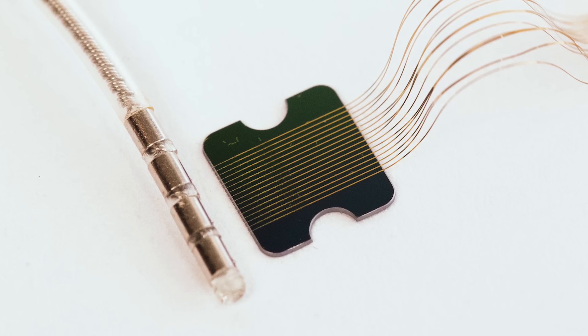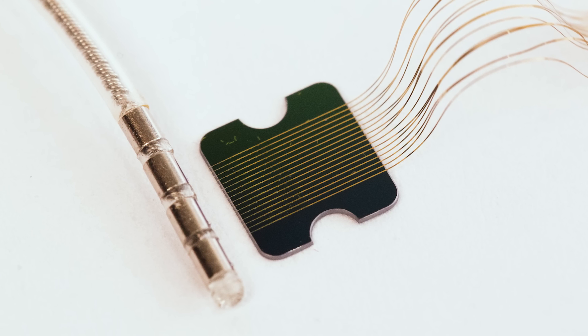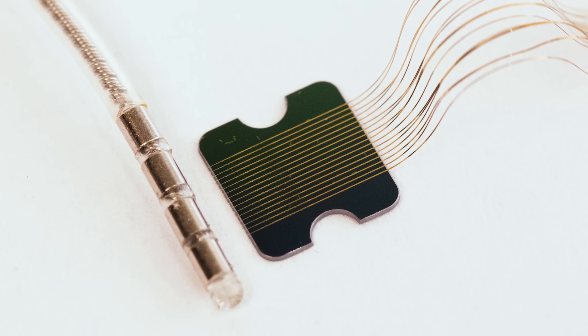The thread is basically a polymer-insulated wire. The metal conductor is a stack of titanium, gold, and titanium — a layered sandwich. They're very tiny wires, two microns in width.